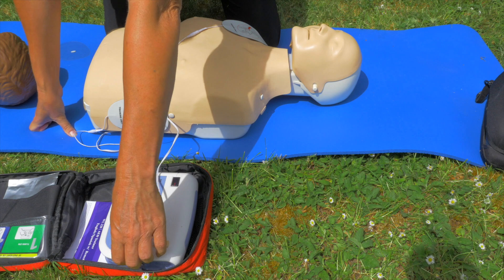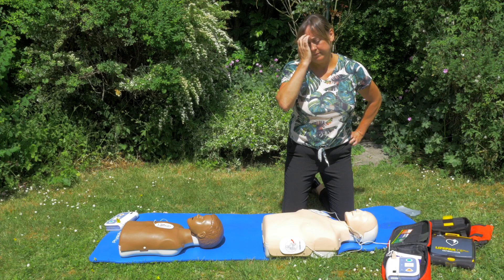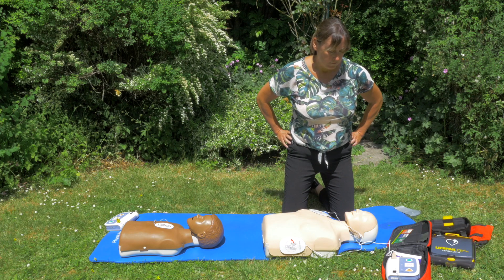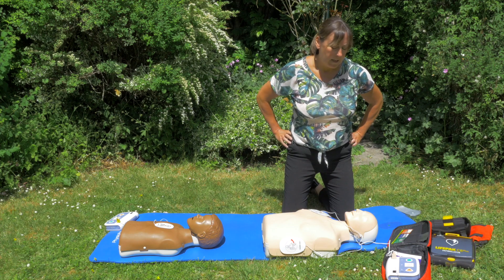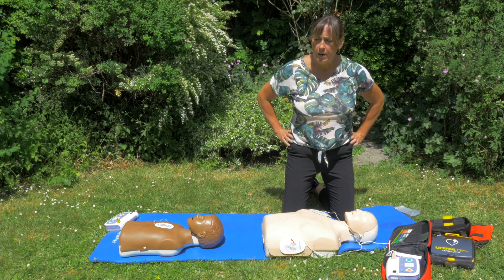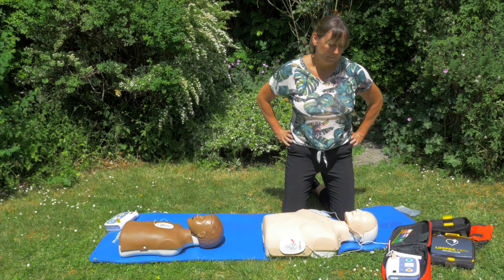The device will say 'Do not touch the patient' — that's for everyone to stay back. Then 'Shock advised,' 'Charging.' So it's getting ready. It will then say 'Stay clear of patient' — again a reminder for people to stay back.